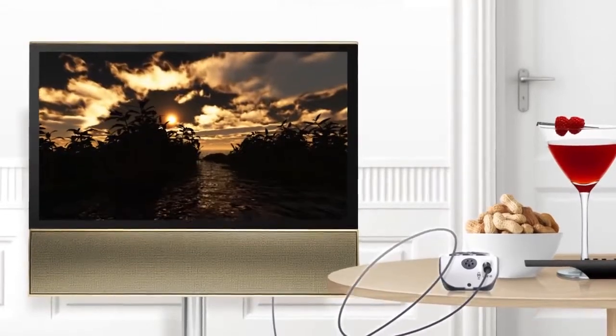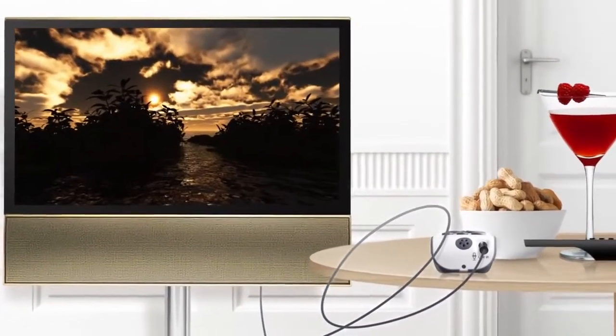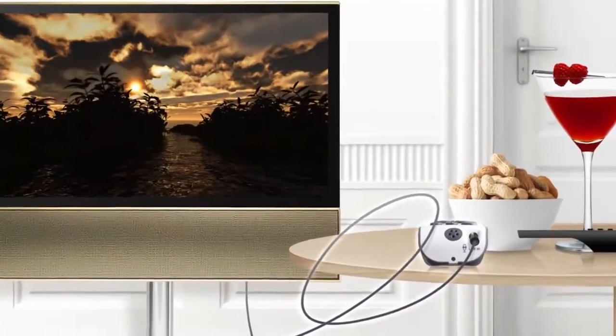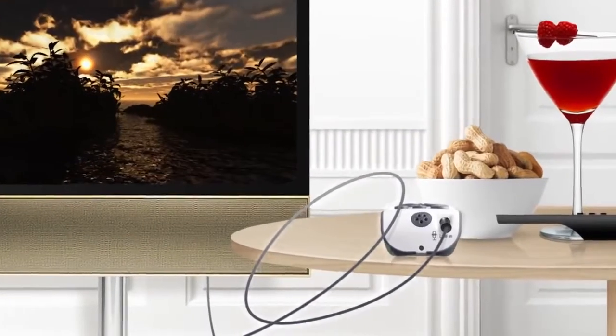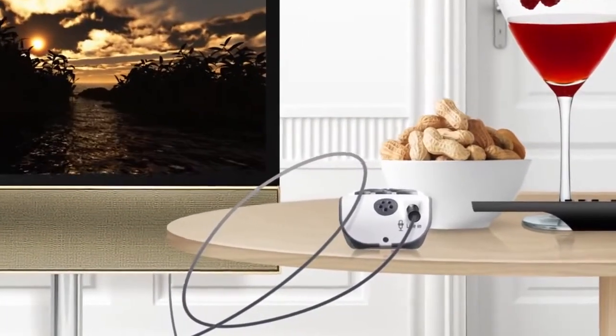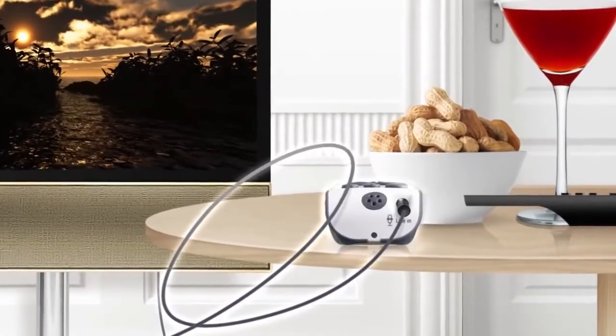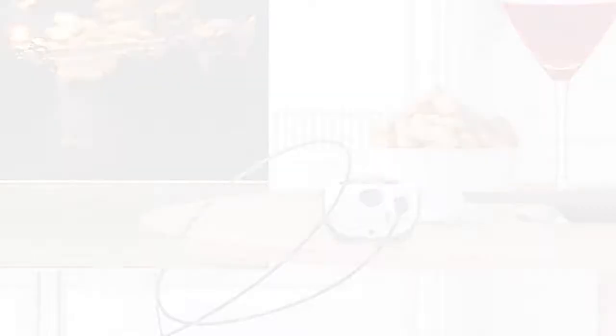Now there is no reason to turn up the volume to hear better. Connect the personal amplifier to the TV or radio with a cable, and you can enjoy great sound in stereo while sparing your family's ears.